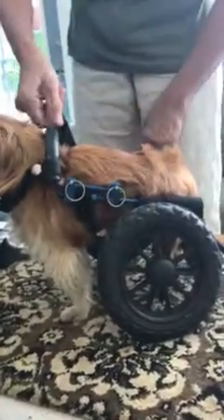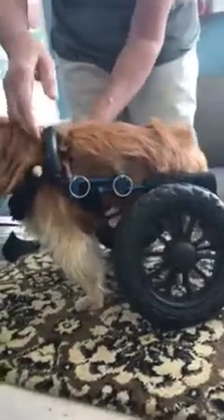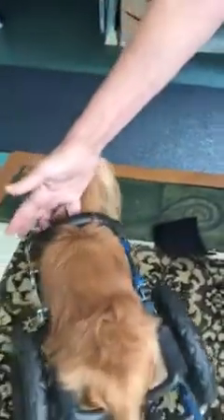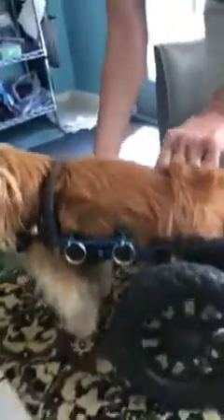Take the end of your support strap, put your finger under the yoke, and pull down — then reattach the support strap so that the yoke is resting on your finger, not on the dog. That makes it neutral, and then you've got it.